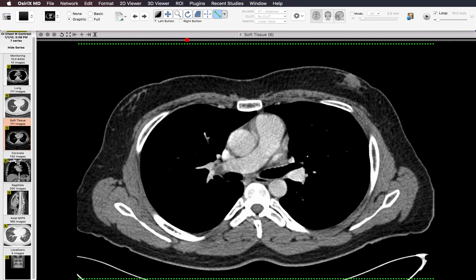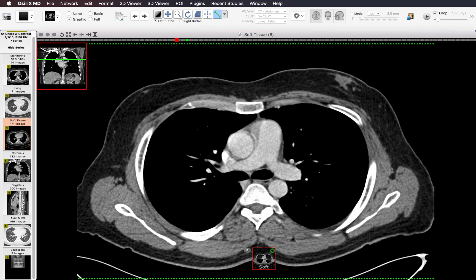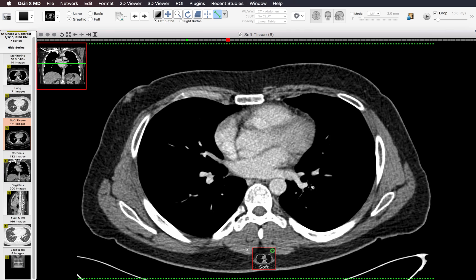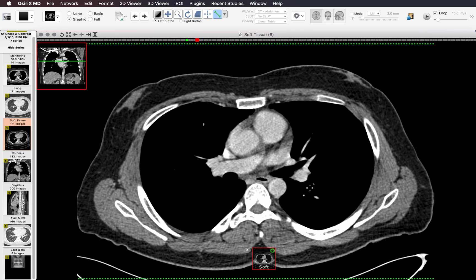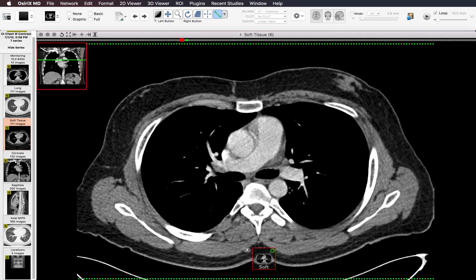The right hilum usually has a lymph node that can be a little bit big — usually around 9 or 10 millimeters — and that's okay. If you don't see any other abnormalities in the mediastinum and nothing in the lung causing lymph node enlargement in the right hilum, I would just ignore that finding. The left hilar lymph nodes are reliably pretty small, so if you see a 9 or 10 millimeter lymph node in the left hilum, that's abnormal and should be pointed out.